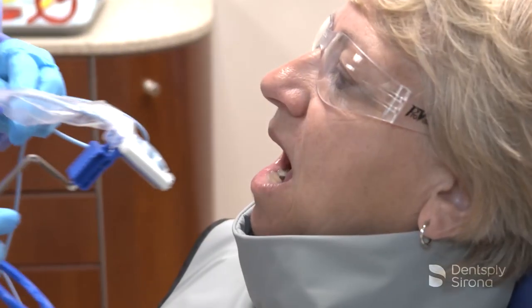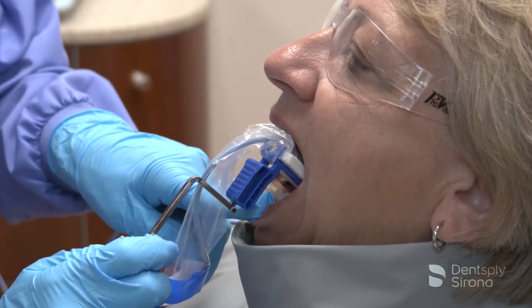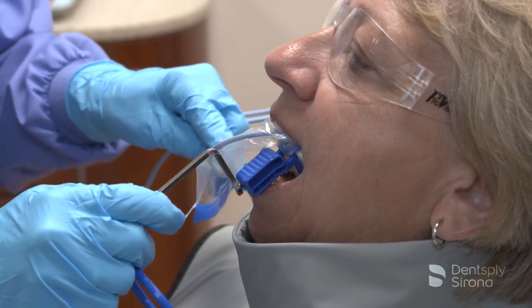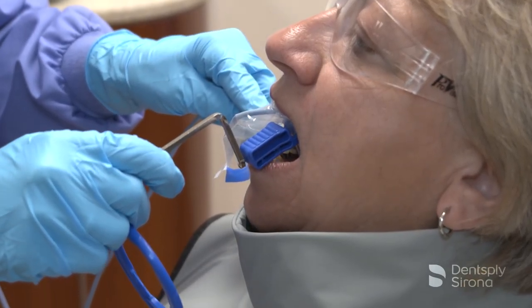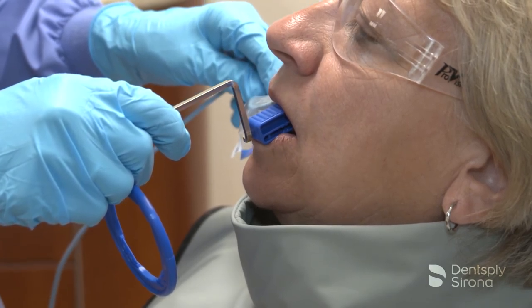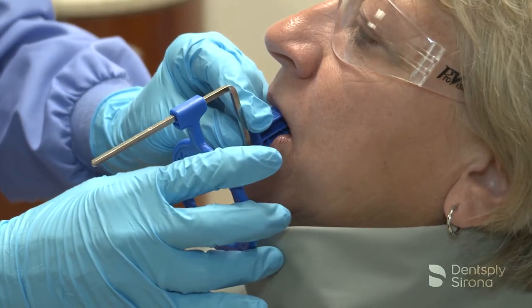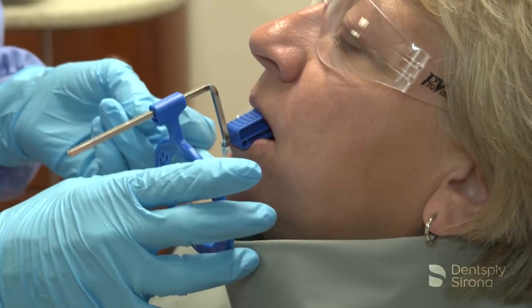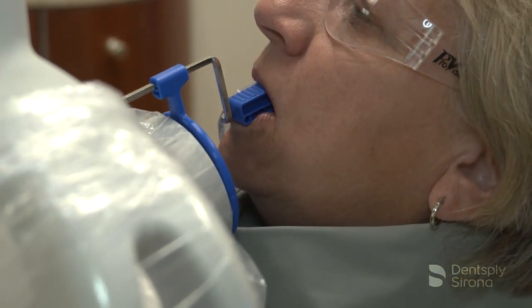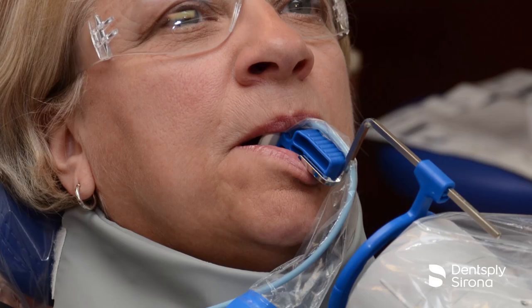For accurate images of the mandibular canines, position the image receptor centered behind the mandibular canine and first premolar, ensuring the receptor is placed in the center of the mouth. It is imperative with this image that the clinician pay careful attention to the horizontal angulation so that the contacts are opened. Place the center of the bite block on the incisal edges of the mandibular canines and instruct the patient to close slowly. Once the bite block is in place, slide the aiming ring down the arm close to the patient's face, align the tube head and center it. The X-ray image is now ready to be captured.